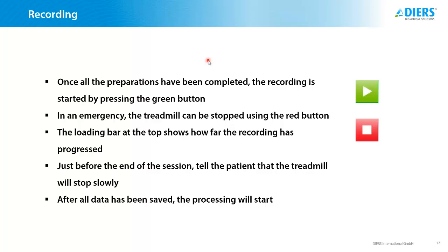Now, just a small remark, if you only make a pressure measurement or if you only make the spinal measurement, saving the data is pretty easy. If you make recordings with the spinal system as well as all the leg axis cameras, as in the pedigate system, saving the data, of course, will take some seconds.